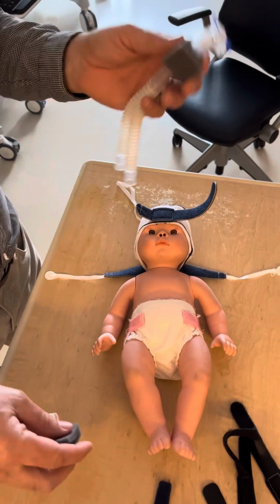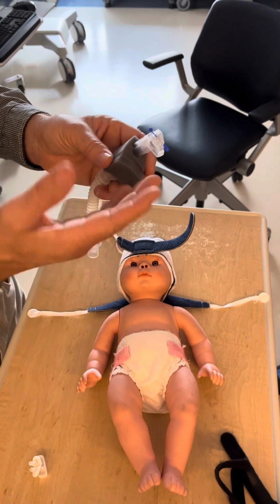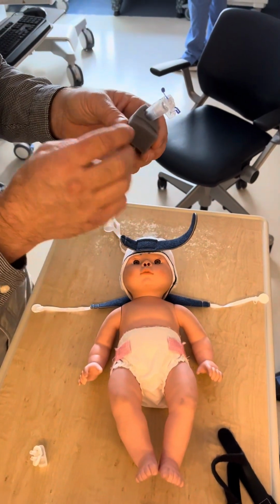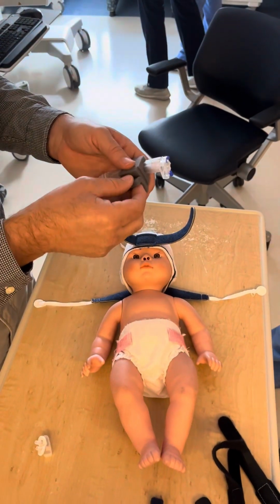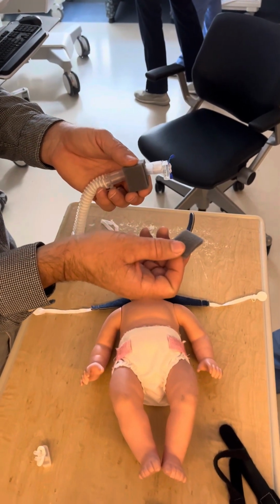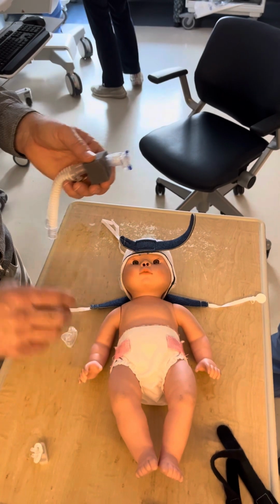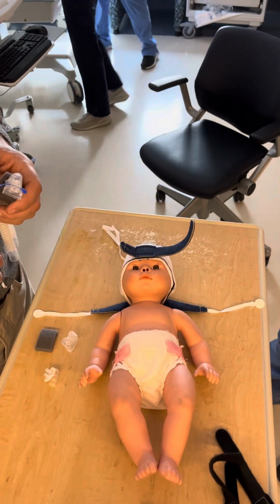This nasal tubing comes with these two foam strips, and these two foam strips provide height. Really, the default answer is you're supposed to eyeball it, making sure that this stays balanced. But I'm going to give you a quick trick so that you can have a baseline to work from and then adjust from there. This first foam strip is used whenever the baby has a coned head. My baby does not, so I've removed it and put it off to the side. The second foam strip is used whenever you're on the mask, right here. And when you're on the prongs, you don't have a foam strip.